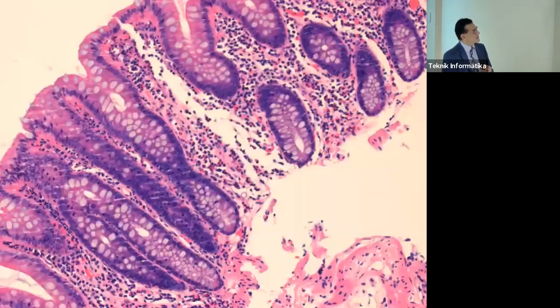So just going back to this one here, I showed you this a minute ago. This is a normal colon. And what we're going to do is mask out the glands, because we're really interested in the stroma. The stroma is this bit here in between these tubular structures. So we need to segment out the stroma or put a mask on the glands. I showed you this before.